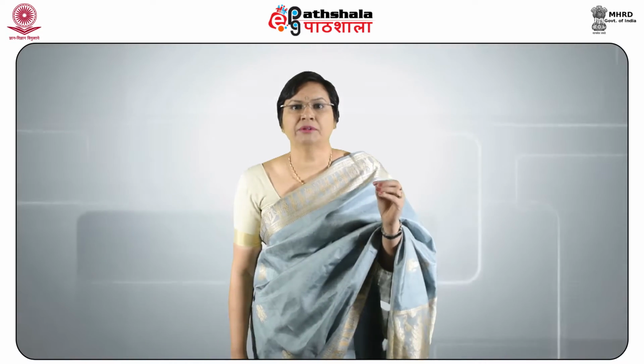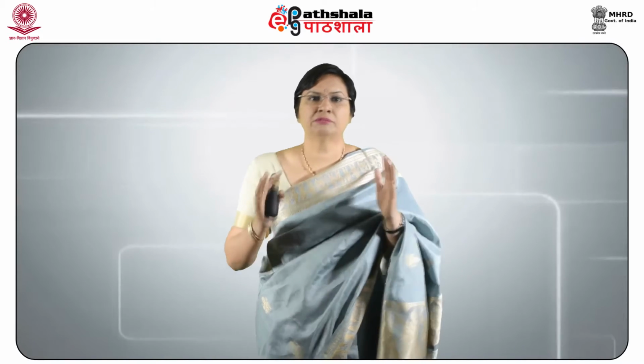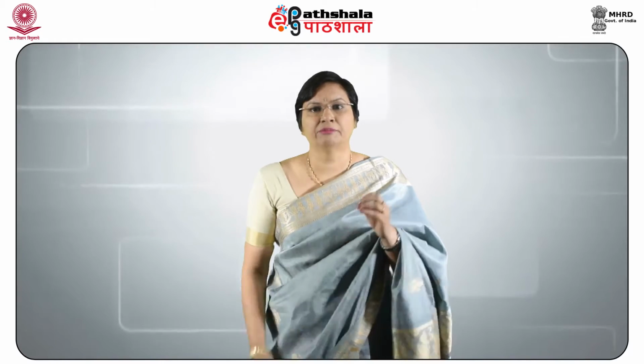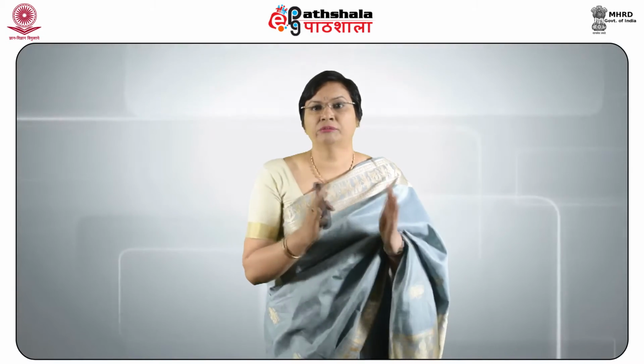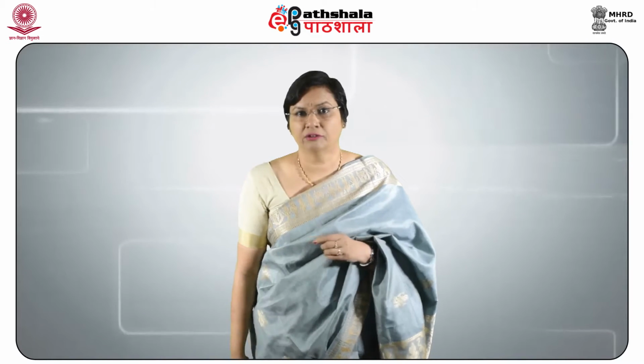The sample must be brought to its vapor state, and it was Martin and James who in 1941 suggested the replacement of the liquid mobile phase by gas in order to improve the separations, and from this time arises the exact start of the expansion of analytical chromatography.